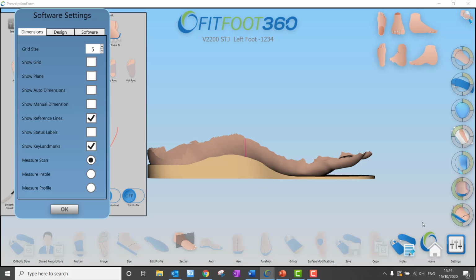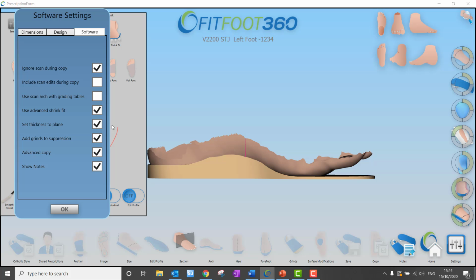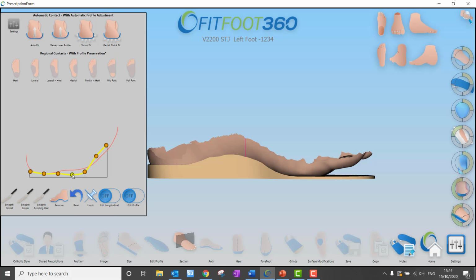If I go back to settings, we can see what it's like without that setting turned on. And if I pull this down now, you can see there is no way I can break through and there is always a set thickness.